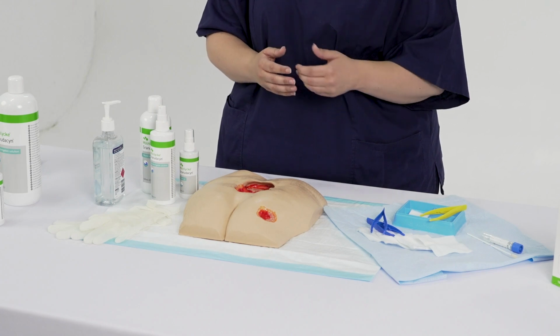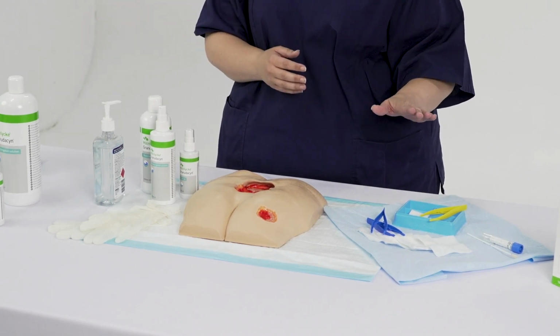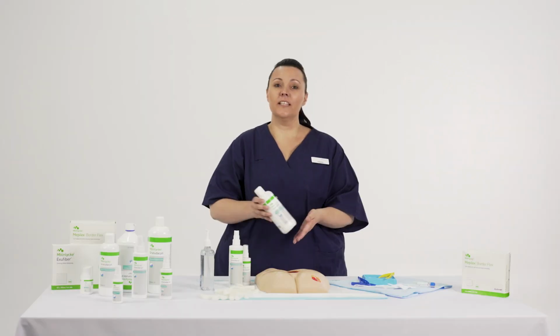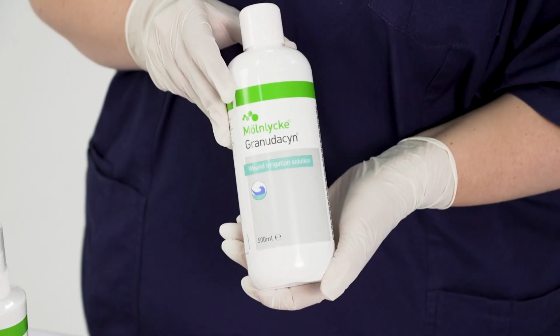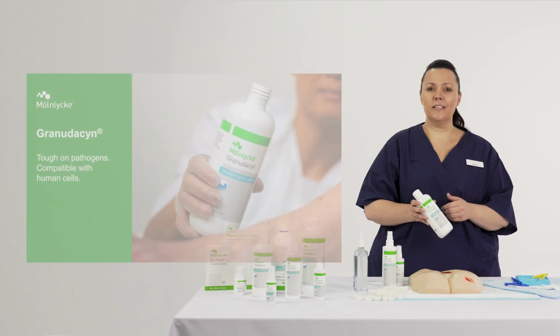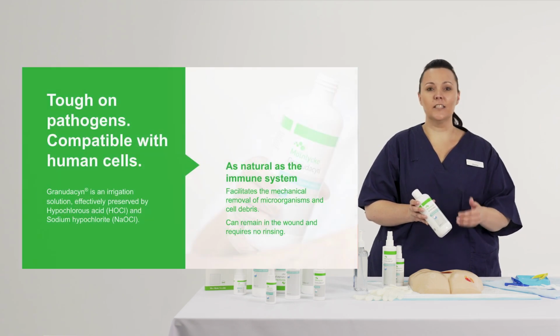We also need to wash our hands, don our gloves, and consider, do we have the appropriate dressing pack, ensuring that we have a sterile field. So today I'm using Granudacyn wound cleansing solution. It contains a hypochlorous acid and sodium hypochlorite. I have chosen Granudacyn because it is tough on pathogens, but compatible with human cells. In addition, Granudacyn quickly facilitates the mechanical removal of microorganisms and cell debris.